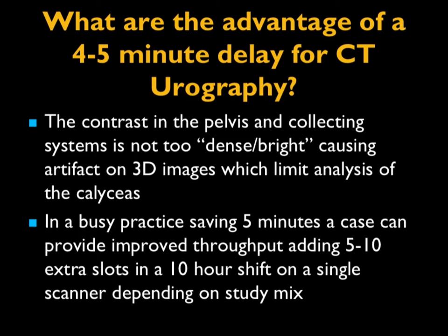minutes will work well. As I mentioned, when you routinely are waiting a long time, you get significant artifacts because of the dense contrast. I think it's also important to recognize in terms of throughput, if you spend an extra 5 minutes a patient and you're doing 40 patients a day, that's 3 hours. So the process, again, works well both in terms of diagnosis as well as in patient throughput. With the 4 to 5 minute delay, which I really like, we don't worry about that dense artifact.